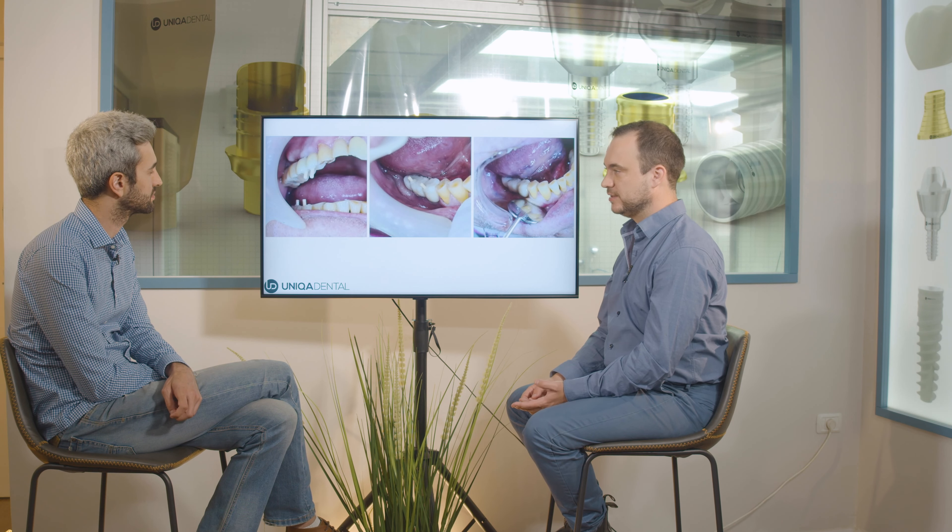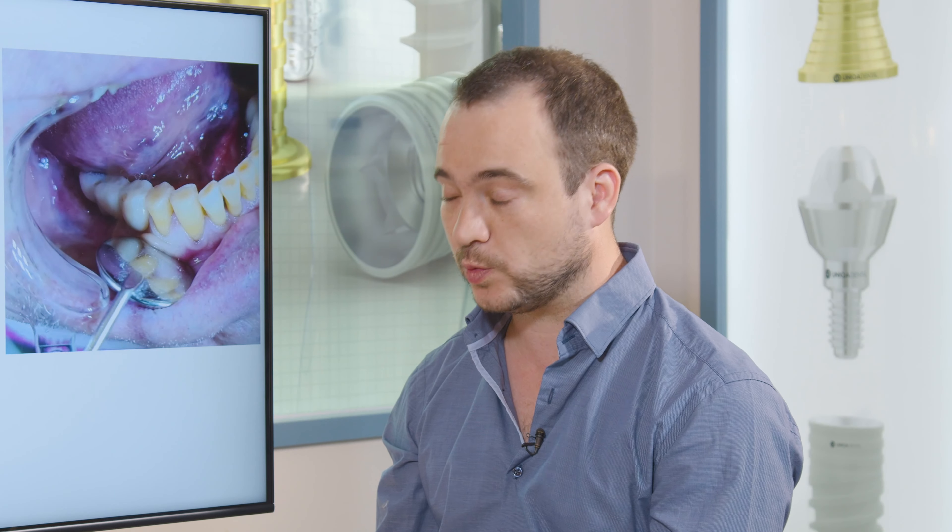We'll wait until the gingiva heals. Since we're changing the upper crowns, we don't want to make the lower crowns permanent right now either — we'll leave them temporary. Later, when we have a fully healed gingiva, we'll scan again to capture the gingival form and make both bridges from scratch, from zirconia or PFM or whatever material is preferred.